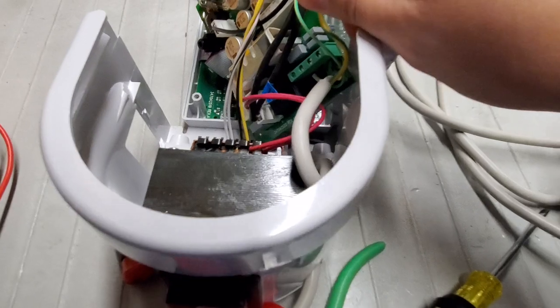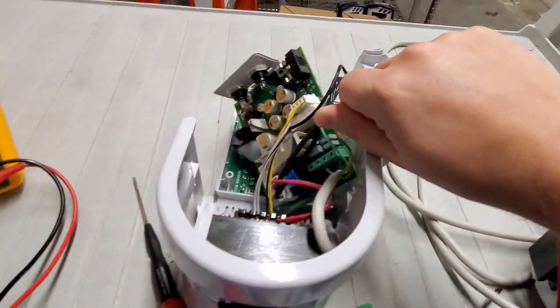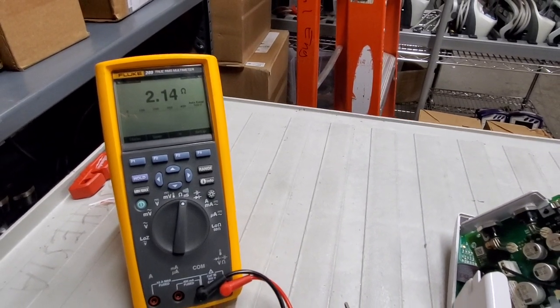And this power cord has never been undone. As far as I can tell, there's no crimps or anything that would damage it. Looks like a perfectly good power cord, but this is how it is on the inside. 2.14 ohms consistently.